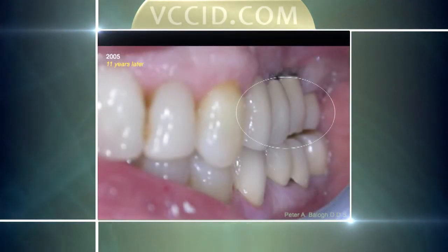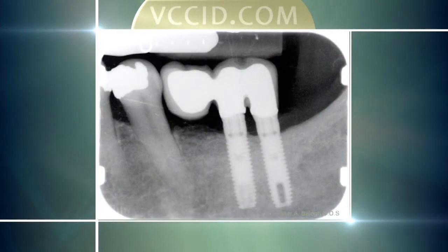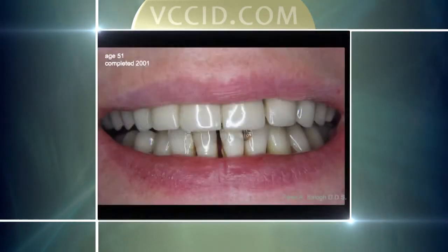I can tell you, I just saw him last week and 19 years later it's still holding well. This person is missing both molars — there it is in the mouth. These are the implants with the crowns in place 12 years after we had done the treatment. It's kind of a funny configuration because of the tilt of that one tooth, but that's holding very well.